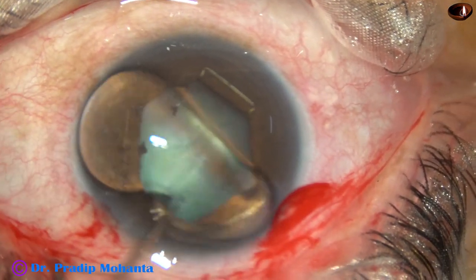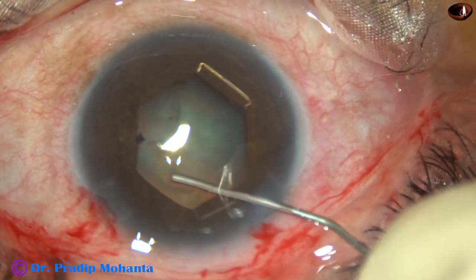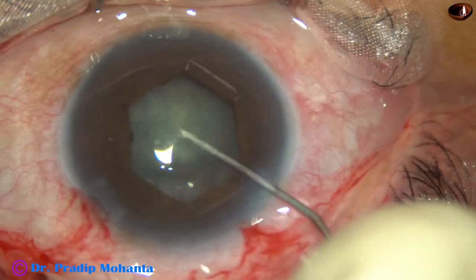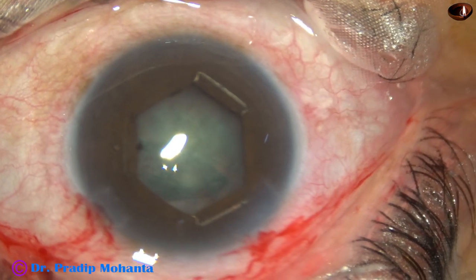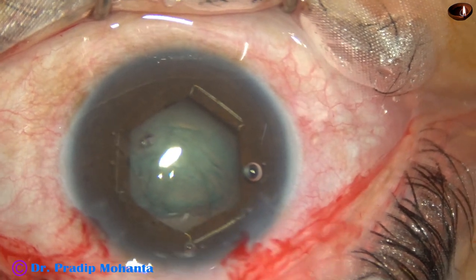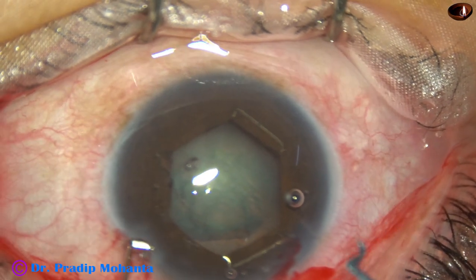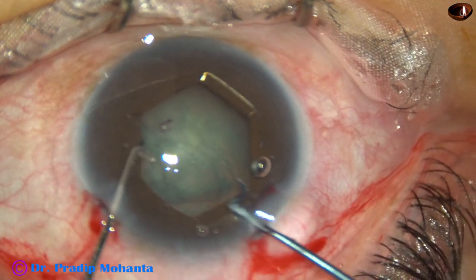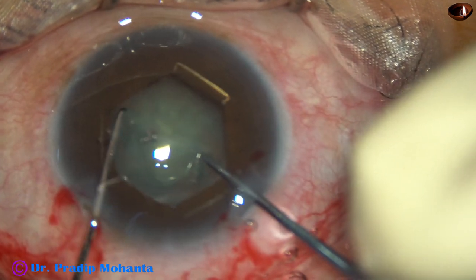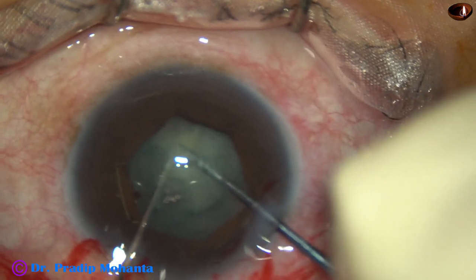Now hydrodissection is done. Now I am using Dr. Sohil's pre-chopper to divide the nucleus into two halves — it is done.